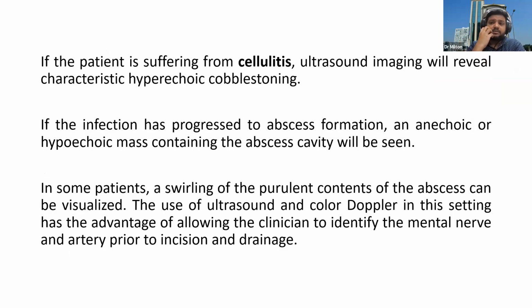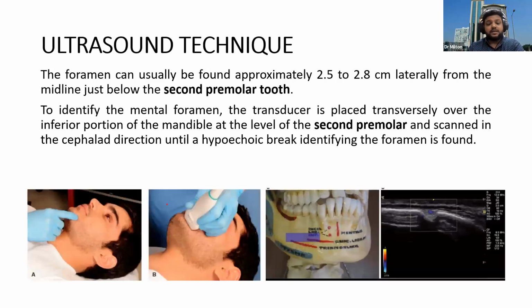Sometimes the subcutaneous tissue is so hard and fibrotic that it causes adherence or fibrosis of the nerve area. So you can identify any changes over this area, a history of cellulitis or abscess, which also causes entrapment or nerve fibrosis.